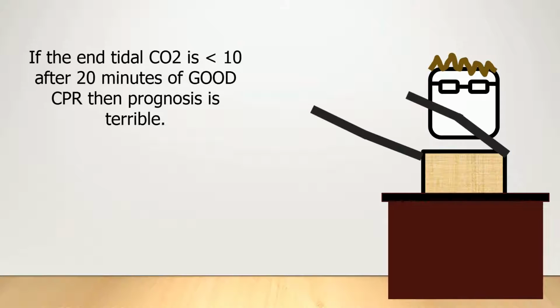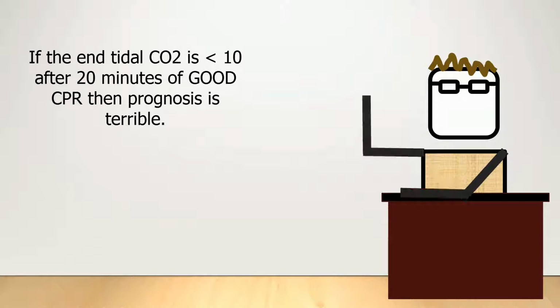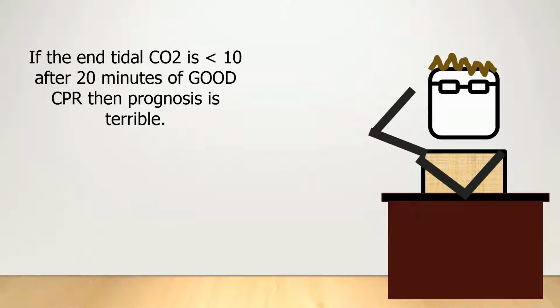On the flip side, however, if the end tidal CO2 stays down during a cardiac arrest despite good CPR, then the prognosis is terrible. If the end tidal CO2 is less than 10 after 20 minutes of good CPR, then the probability of death is very, very high.